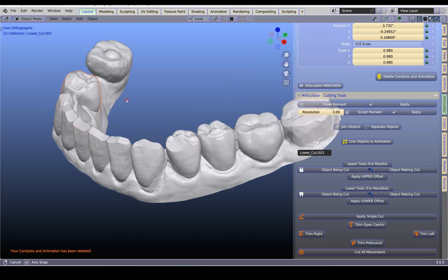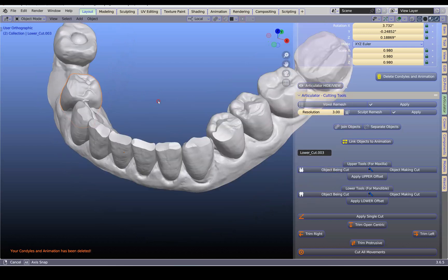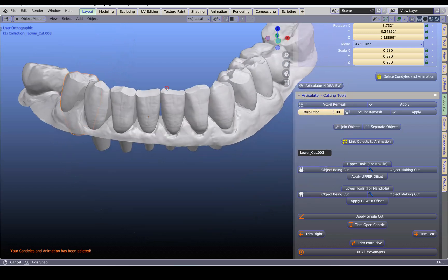I can smooth these teeth down before I start, but there's no need because we can do this during the crown-making procedure. Hope you liked it and if there are any questions feel free to ask. Thank you, bye.